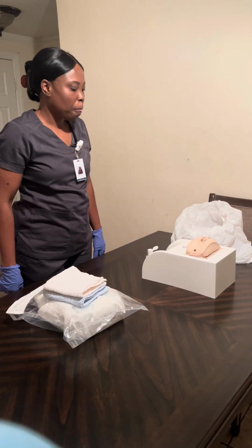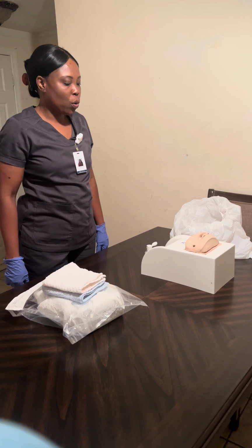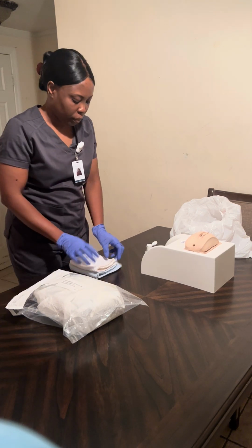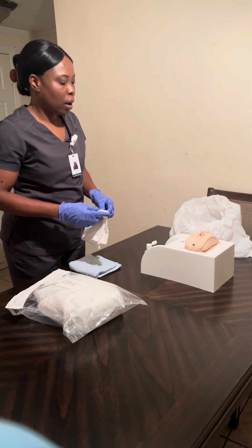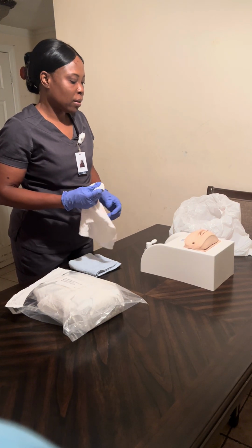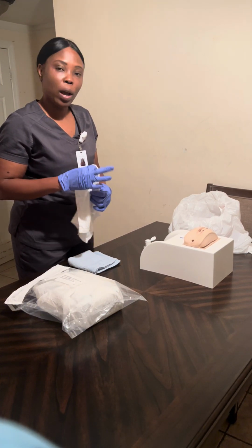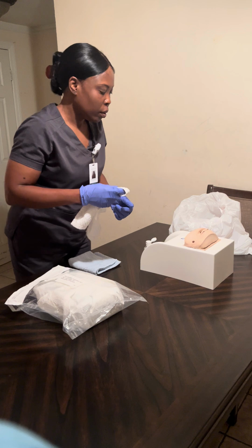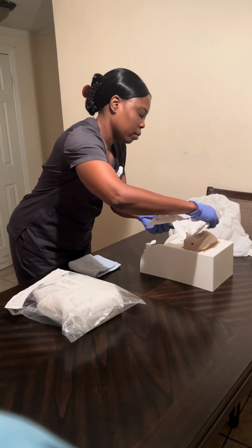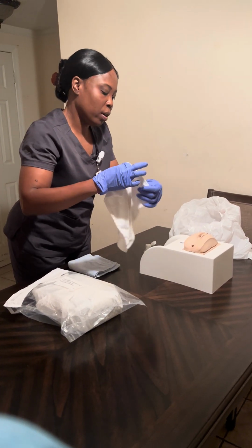First, I'm gonna clean the area. I'm gonna take my wash clothes with no rinse soap and water. I'm gonna bump the head of my patient up to a high position. First, I'm gonna clean the area from the top to the bottom, anterior and posterior. I'm gonna fold it.